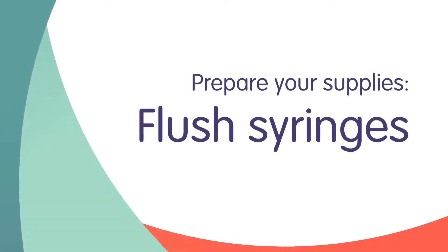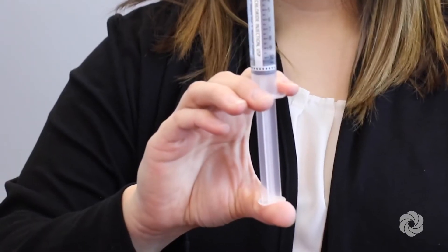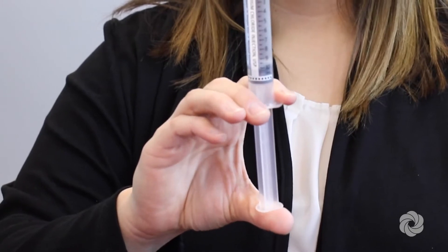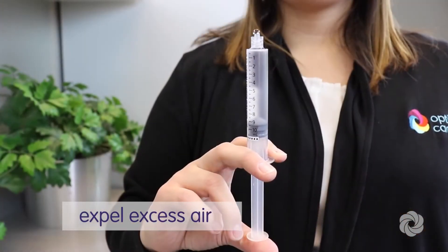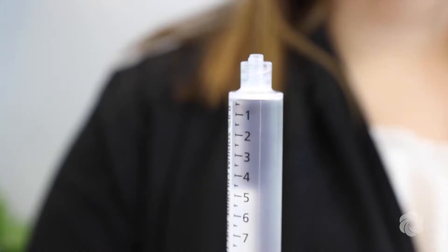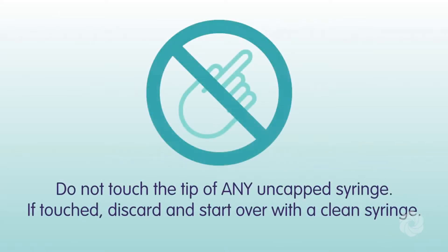Next, prepare your flush syringes. Prior to using syringes, push firmly on the thumb press with the tip cap still on, just until you feel the plunger move. Expel air and excess solution by twisting off the tip cap and pushing the plunger forward. Push out extra solution to the amount instructed by your nurse. Finally, replace the syringe cap, being careful not to touch the tip of the syringe with your hand.